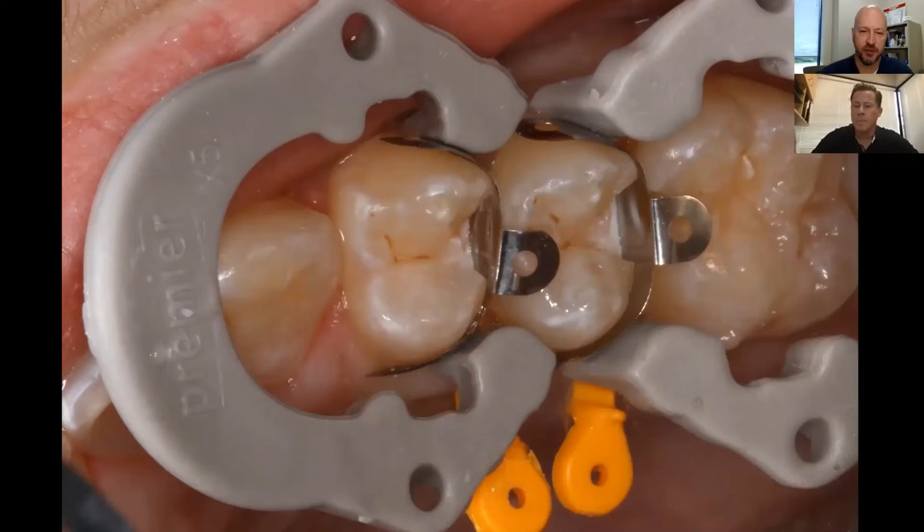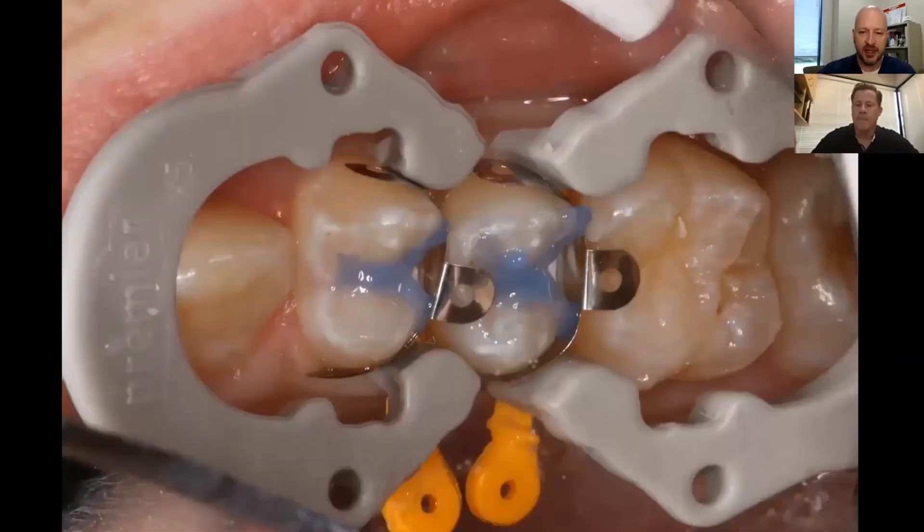I love the photograph — the way you angled it — because we really like to see at the bottom of that box that enamel margin, since we know we can get a durable bond down there with a little bit of enamel. Moving on, it looks like you're doing selective etching here. I'm a self-etching guy for the last five or six years; I don't do much total etching. But anytime you can get phosphoric acid onto the enamel, do it — that's my understanding of the research. It gives you the best enamel conditioning possible. I left it without going down into the box form just for the sake of not disturbing the smear layer on the dentin component. That's the selective etch technique I incorporate with all my restorations whenever there's enamel.